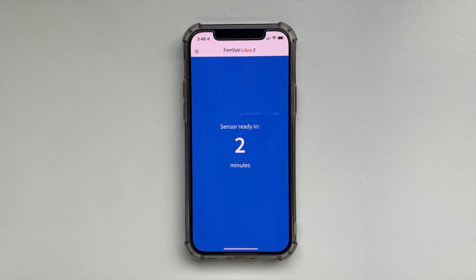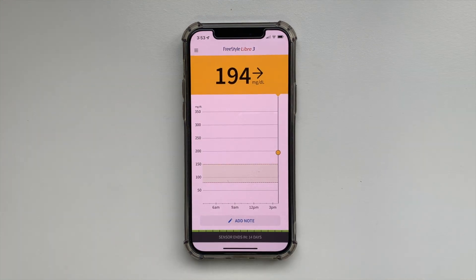Once the 60-minute warm-up passes, you will automatically start receiving your blood glucose data from the sensor in the Libre 3 app. The number will update every minute for the next 14 days. You don't need to scan your sensor — you don't even need to look at your phone — because the readings will be automatically recorded on the phone and uploaded to your LibreView account.